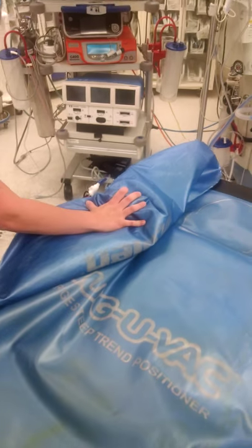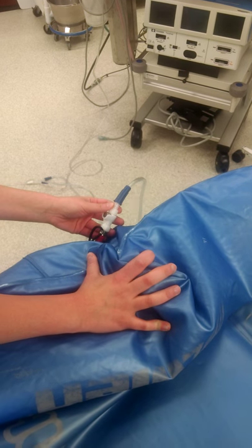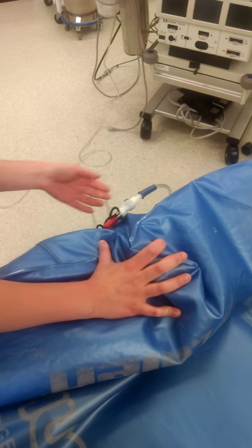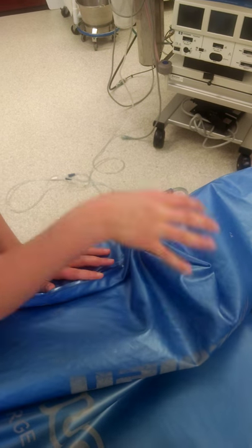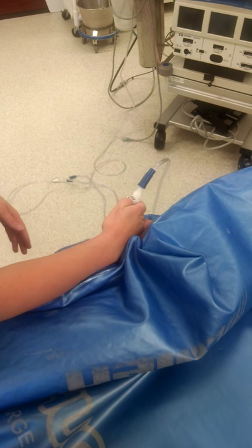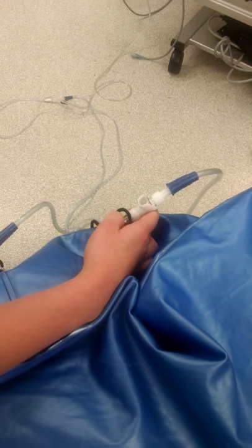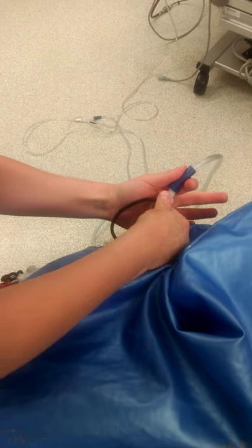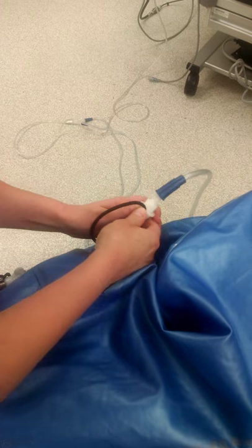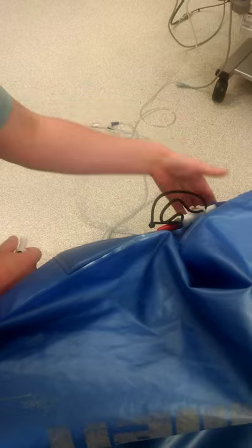Just like that — this valve is pushed in, the suctions are on, and that is suctioned. Once the bean bag is hard, what you would do is pop out using the silver button, and then these clips right here clip into place so that it holds suction. These do not have to be kept on continuous suction.